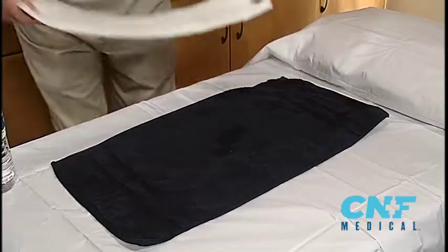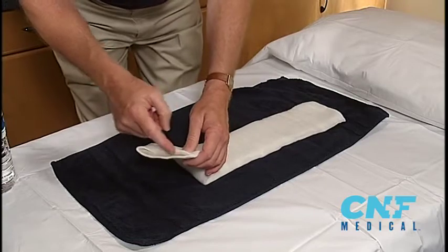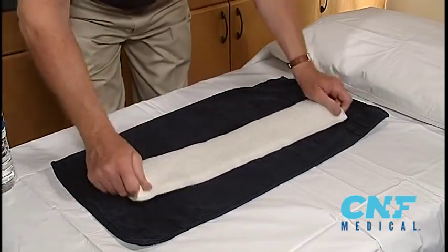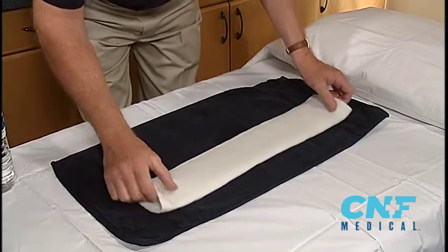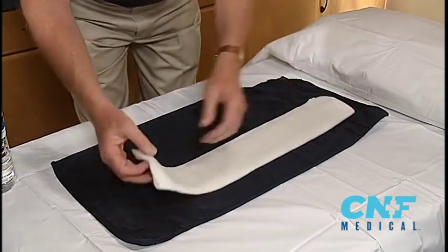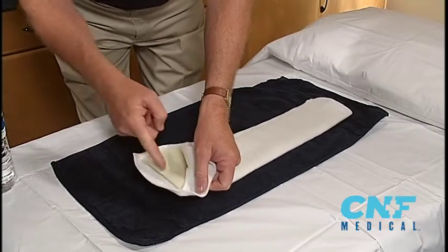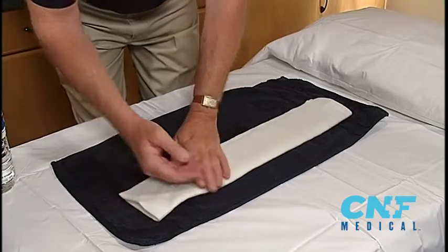Nicely sealed. Now on these edges, protect the patient from the fiberglass — very important. Stretch the padding, stretch once, turn and stretch. As an option, you can open this up — remember the double face tape — open if you want and just cut that off with your scissors. But we find this is enough stretch here. You protect it.